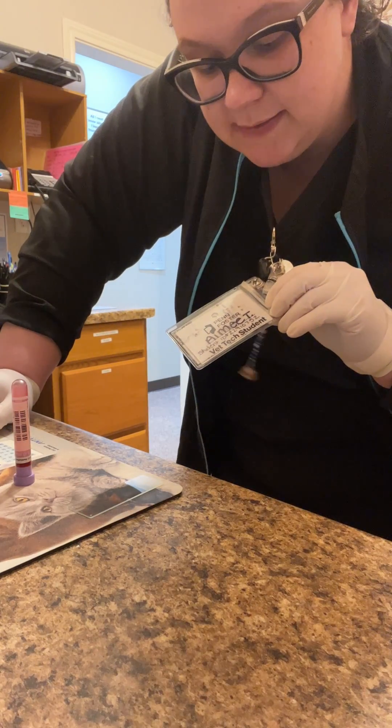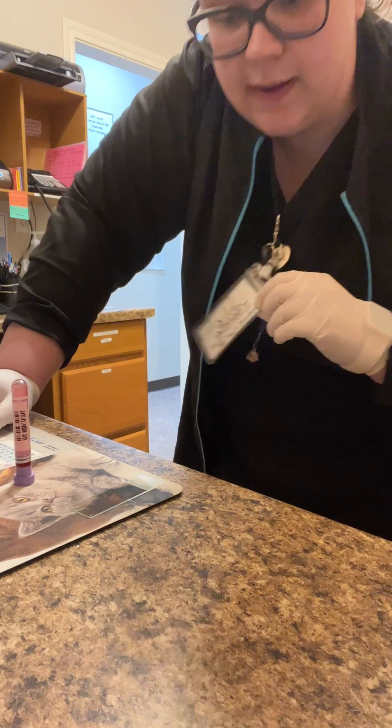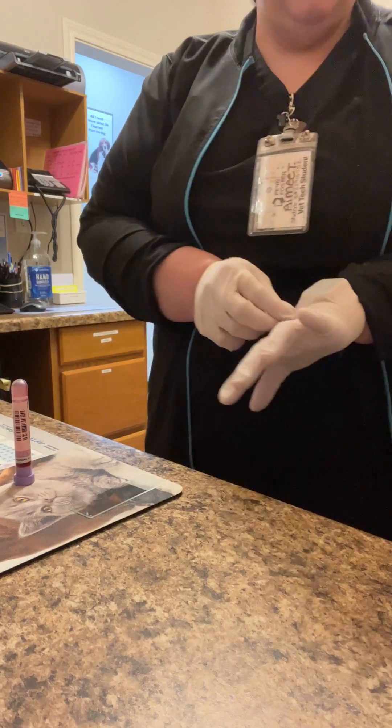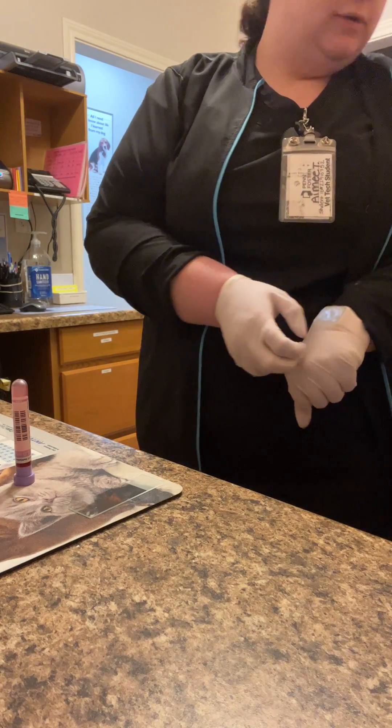I'm Amy Thornton, student ID 22910752, and this is for skill number 26, a saline agglutination test.